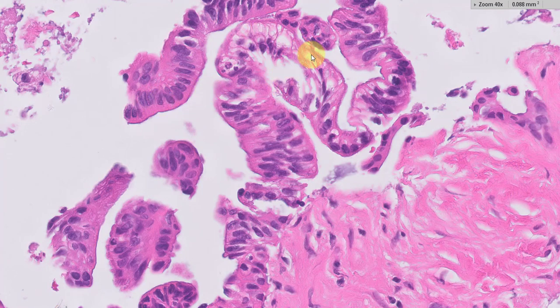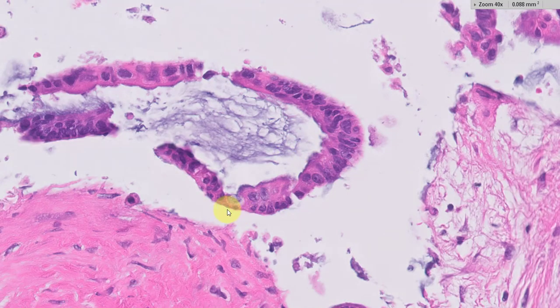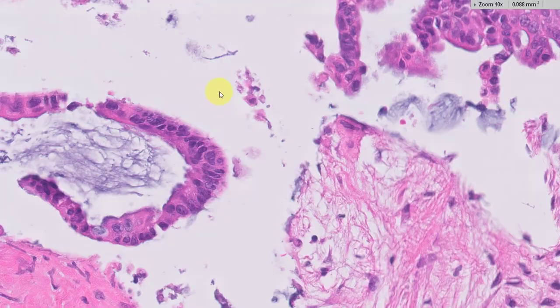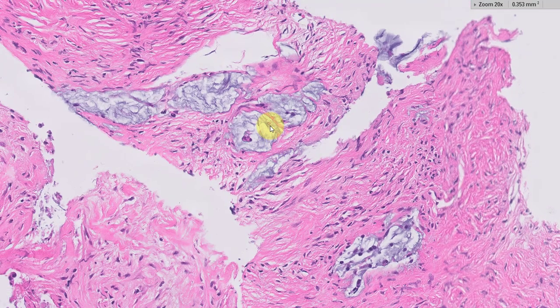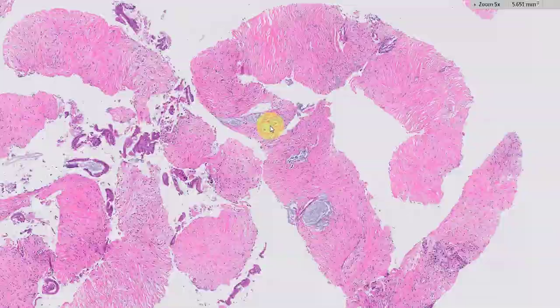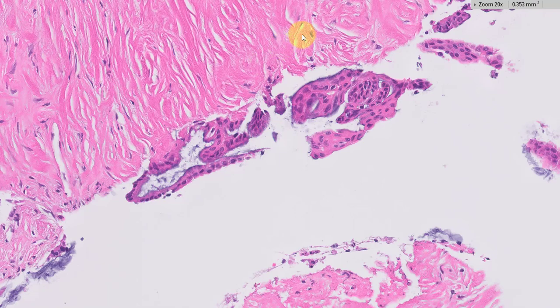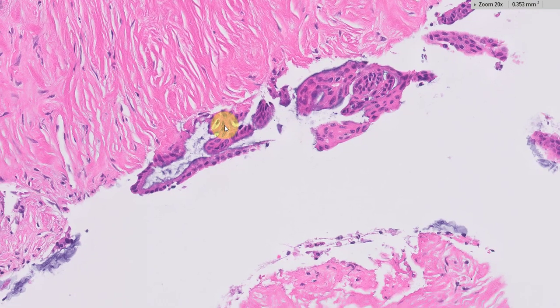Some of them have clear cytoplasm at the periphery, and some of them almost look like goblet cells. There are areas in which there are pools of mucin. And here again there is fibrosis, or desmoplasia, depending on how you look at it.